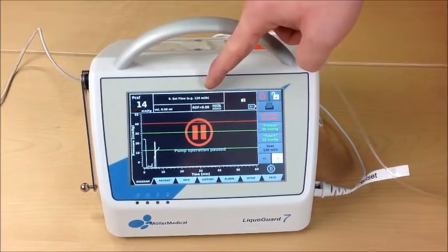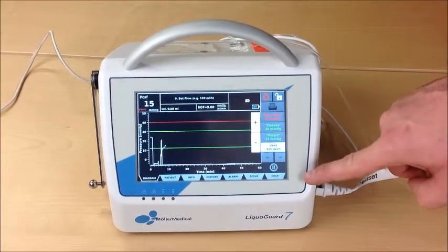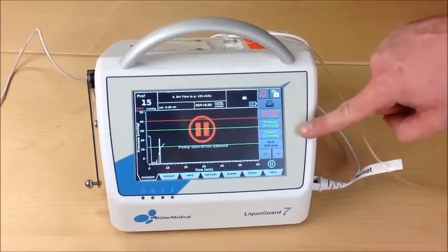Set the flow rate — for example, 120 mL per hour — by pressing the VSET button. Adjust the flow rate to a suitable value; 120 mL per hour is a good value.